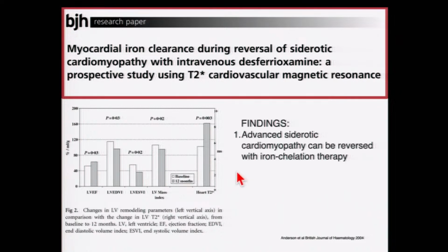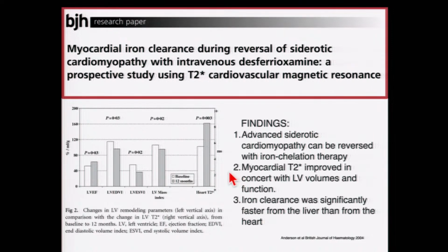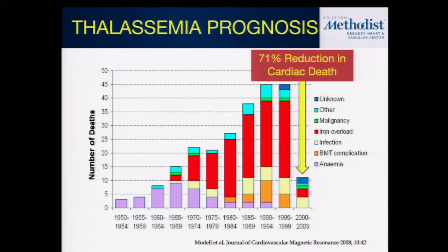And in fact, T2 star values have now become really the mainstay of how patients are evaluated for iron overload throughout the world. And this is just kind of an interesting graphic from the UK, which looked at the incidence of cardiac death amongst thalassemia patients in the UK population. And they noticed, and again, notice this T2 star technique became mainstay in the UK around the early 2000s.